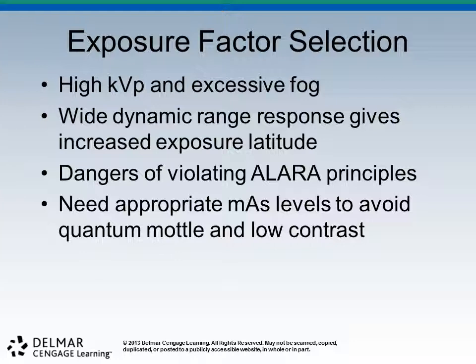The danger side of this, you see right here, is violating the ALARA principles. And remember, I don't know that I said the acronym, but it is "as low as reasonably achievable." That's what that stands for. So going in there and just shooting a really hot technique because you know you can get away with it, that's an ALARA violation. That's an ethical thing. And we're now in the industry recording exposure, so you will have an absolute responsibility to document how much radiation you use on somebody.